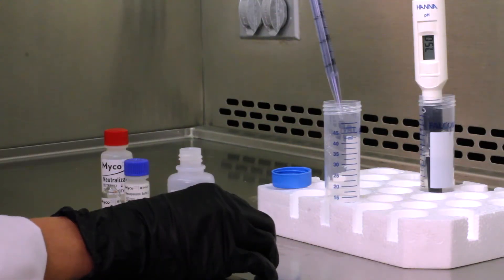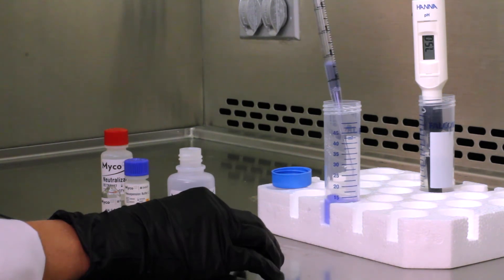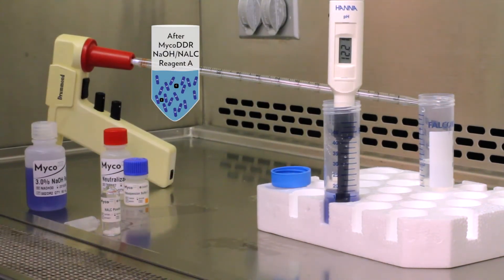Similar to the current procedure, the pH is elevated to properly decontaminate the patient sample. However, the Myco DDR sodium hydroxide NALC reagent A has an integrated blue color-changing pH indicator. This turns the sample blue and will be instrumental during the neutralization stage.